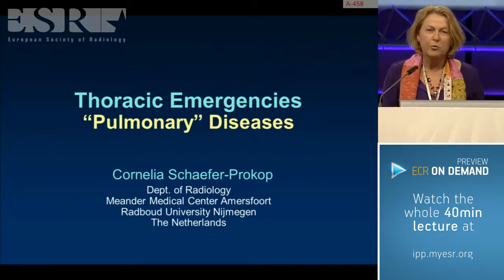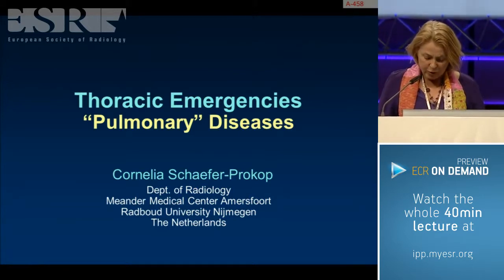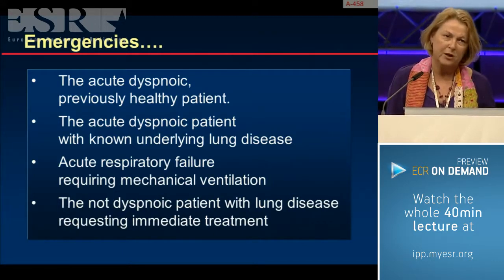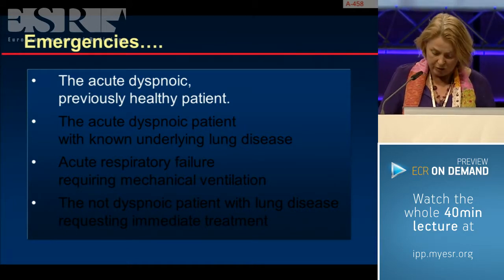My topic is now the pulmonary diseases. And this is actually a huge topic. It's very broad. So I designed several scenarios, several situations, and I want to discuss these situations with you and some examples. So we start with the first one, and the first one is an acute dyspnoic, previously healthy patient.